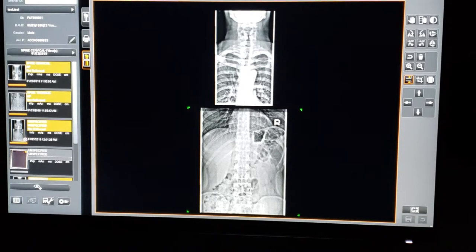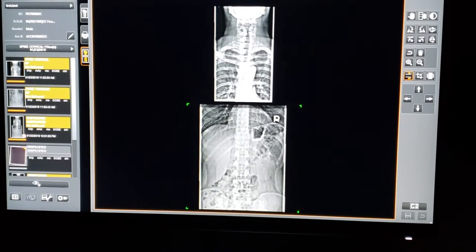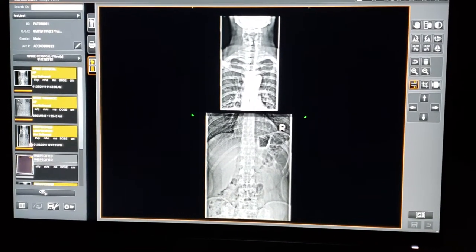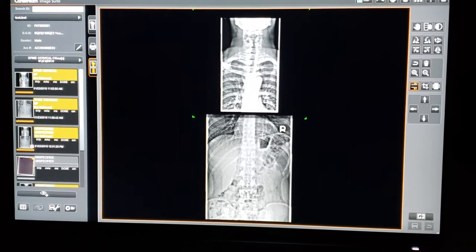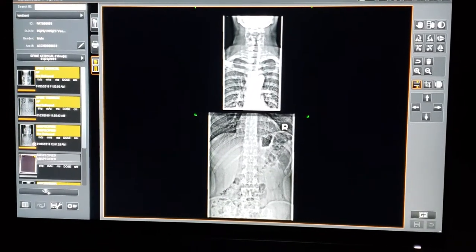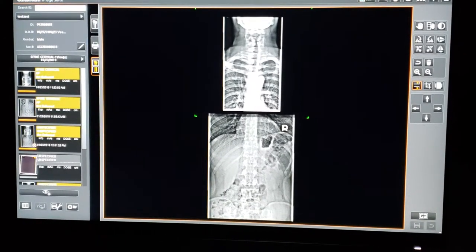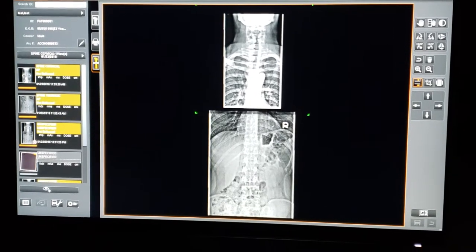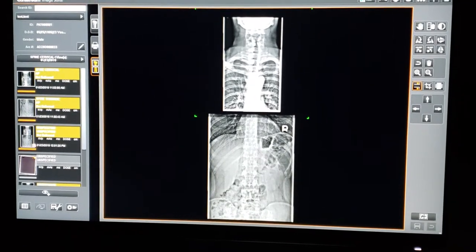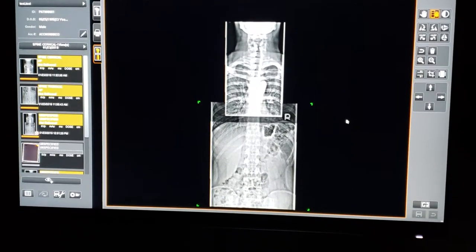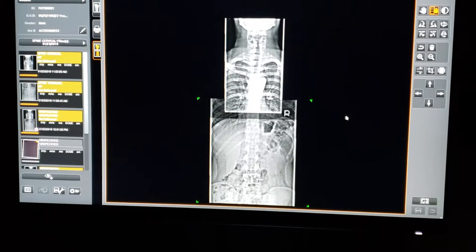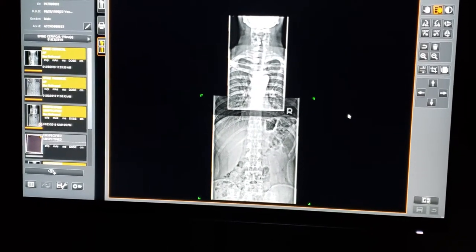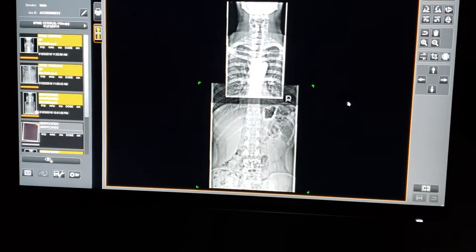With the fiducial tool, you will place a dot on the same landmark on each image. So if we start at T1, 2, 3, 4, 5, 6, 7 — place a dot right on the spinous process. And then on the lower image we're going to come up from T12, 11, 10, 9, 8, 7. We're going to click there also, and it will place the images over each other as they're supposed to be placed according to where you've clicked.